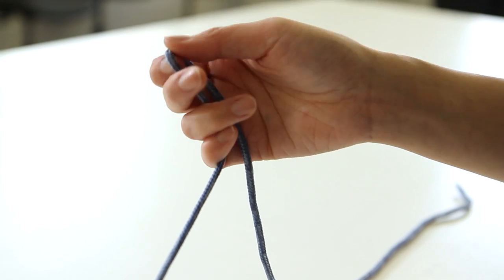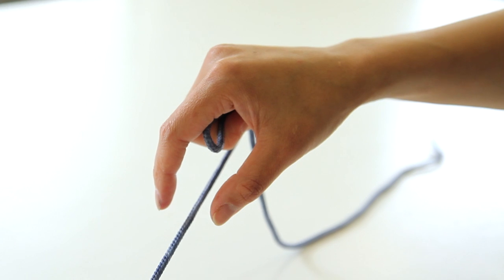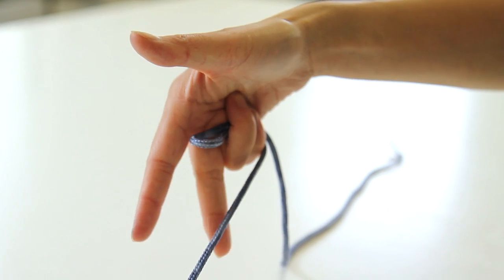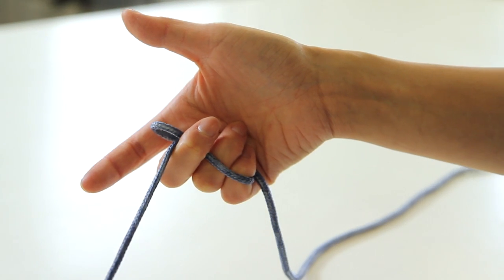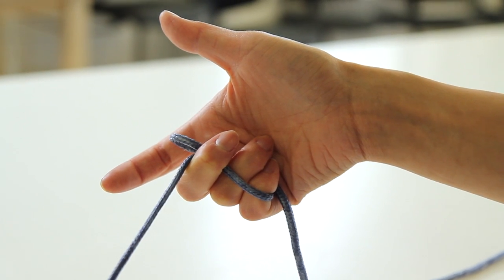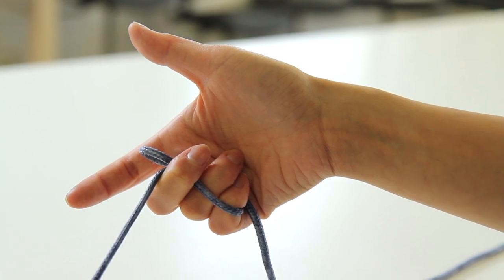The locking maneuver prevents the suture from slipping through the hands and secures a comfortable working distance. After gathering to the desired distance, instead of pronating to re-grasp the suture lower with the thumb and forefinger, use the third finger to hook the suture into the grasp of the last three digits. This prevents the suture from sliding out of the hand and accidentally lengthening the working distance, while simultaneously freeing the thumb and forefinger to form knots.